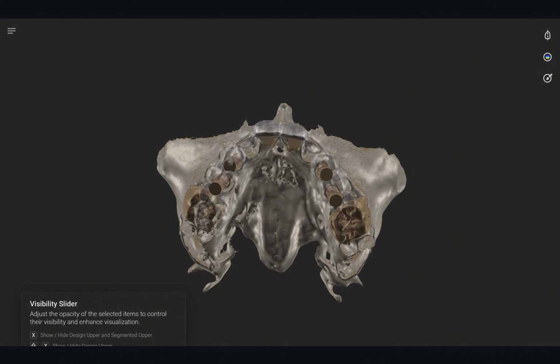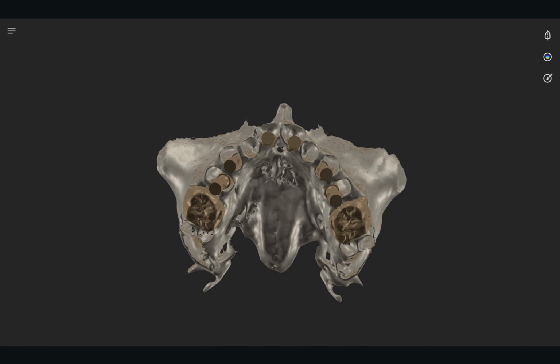And having that prosthetic implant interface also means that we can really think about how to approach extracting the teeth, cultivating the sockets and preserving them, creating those forms. Being able to segment out the individual roots allows us to look at what's going to be the best custom healing abutment, pre-making them so that as soon as you're taking that tooth out, you're putting in something that is biologically identical in terms of that profile and cross-section.